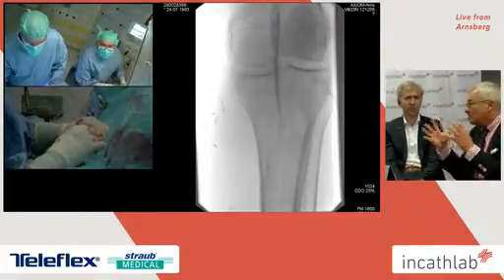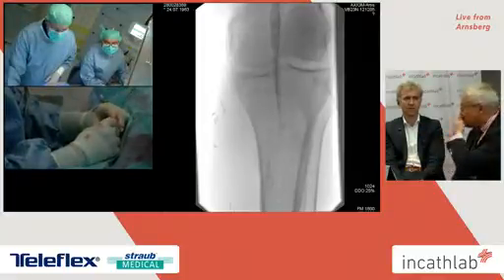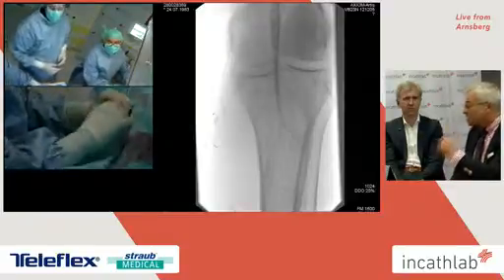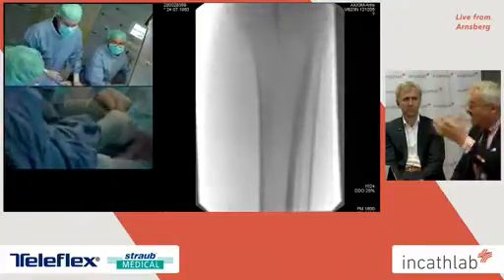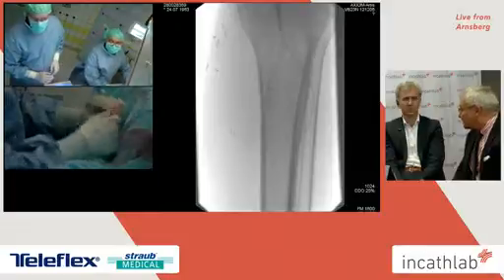But I don't know, I don't have experience with this system. So probably the amount of complication such as distal embolization is not so high, and we could manage with this approach.